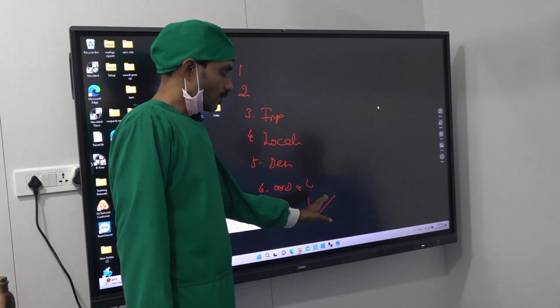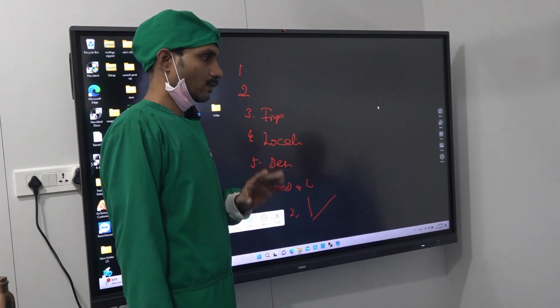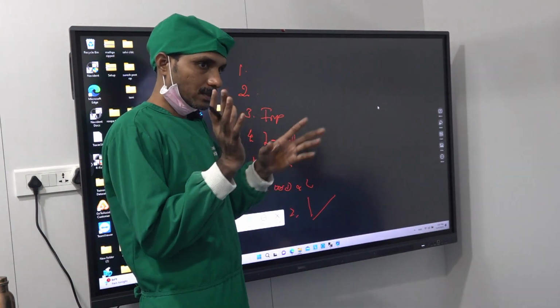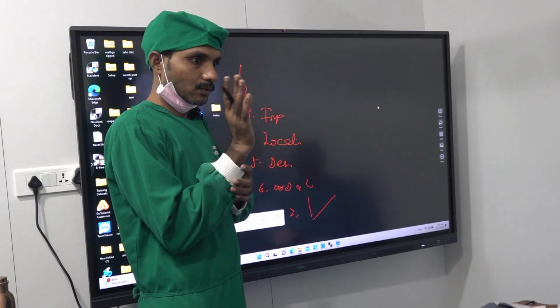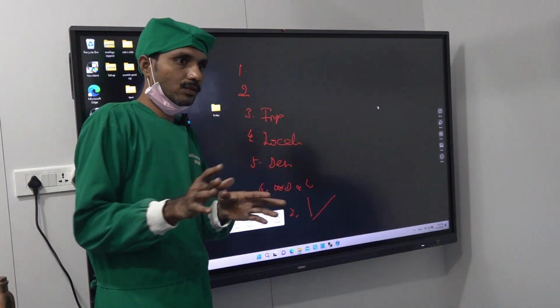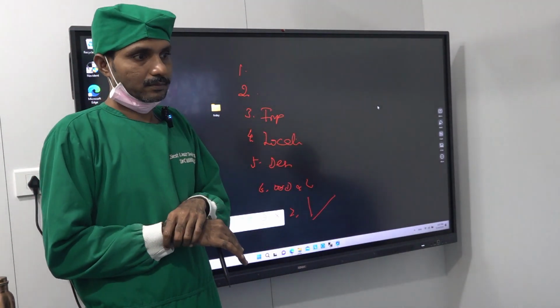When not to place an angulated implant? When the bone is soft. When the bone is soft, don't place angulated because you cannot bend. Even if you bend, the implant will move through the bone. It won't bend at the neck, whether it is multi-unit or single piece. In those situations, a conventional implant is better.